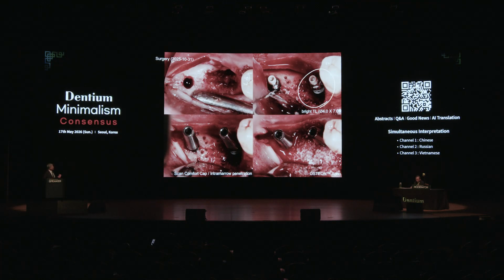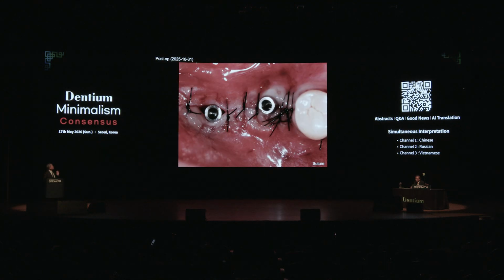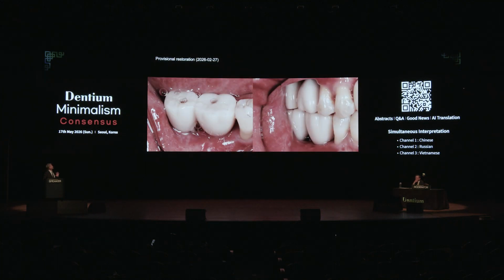So in a contained defect, at first we tried to place the xenograft. Over that, on the contained defect, we grafted the collagenated bone, and that was covered by the collagen graft. Also, sometimes we consider labial or buccal flap movement, and to prevent the motions, nowadays we try to place a little bit denser collagen graft on the buccal side. With the suture and the temporaries, the patient has been functioning well for around 3 to 4 months. But still a problem is not enough keratinized gingiva.